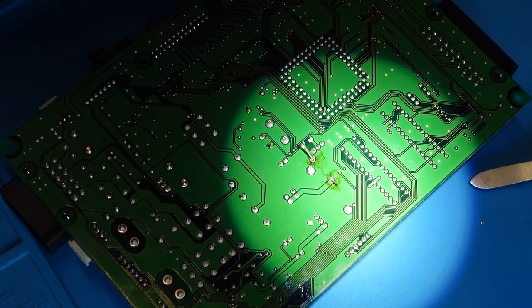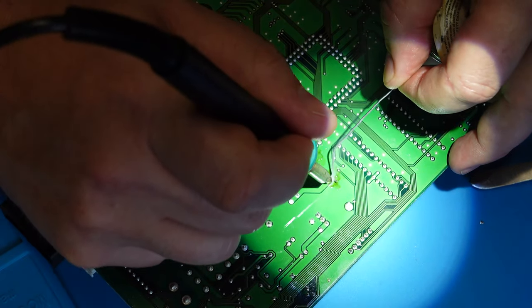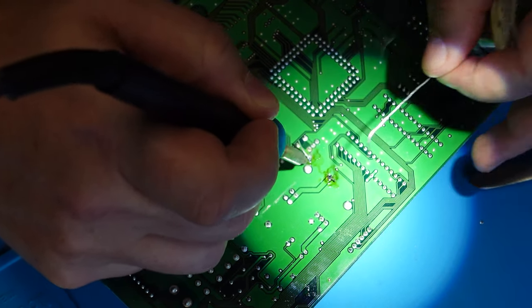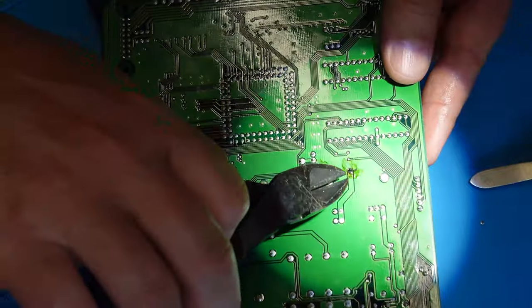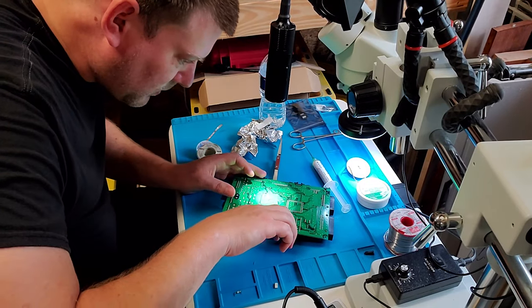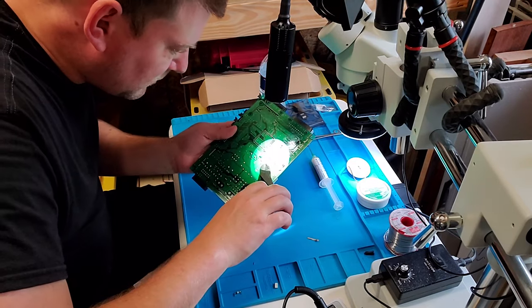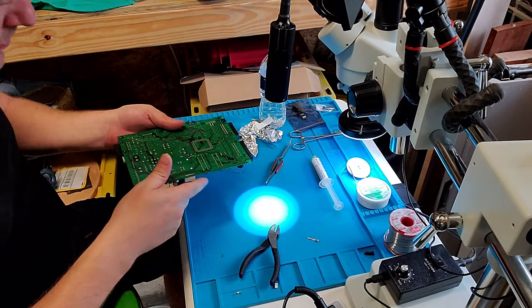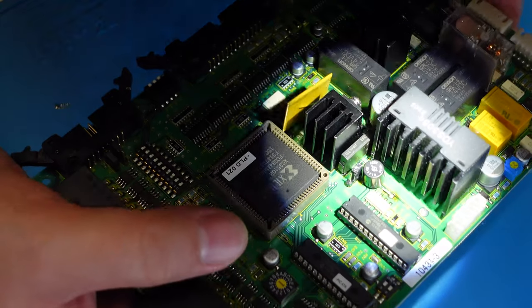Then I'm going to go ahead and take my soldering gun, and I'm just going to put a spot right on those traces. There we go. Next step, let's clip them off. Make sure it's as flush as possible. So the fuse is in.